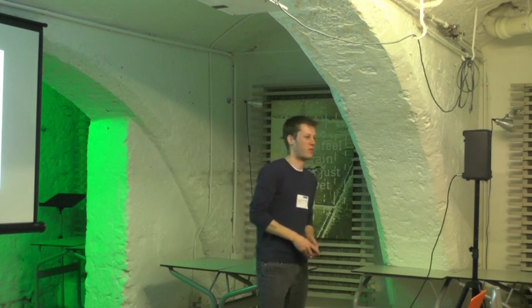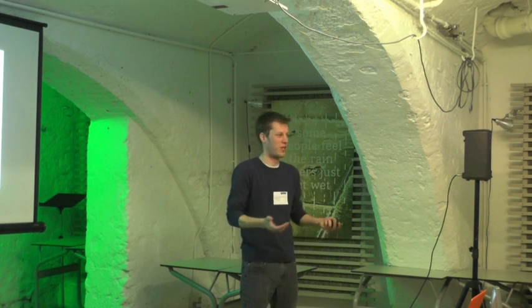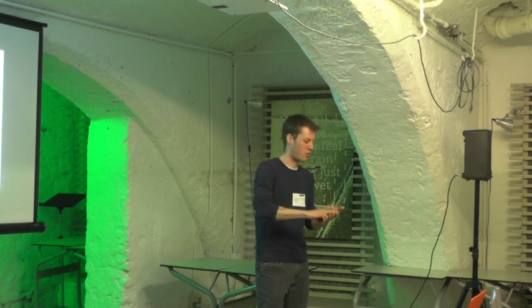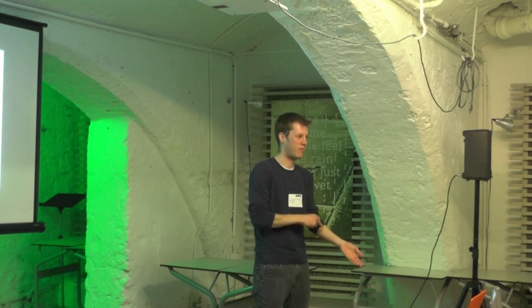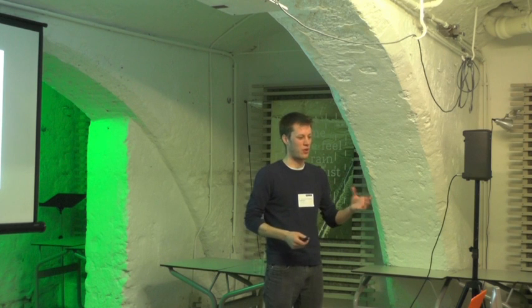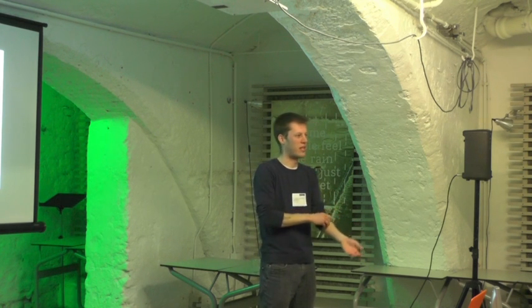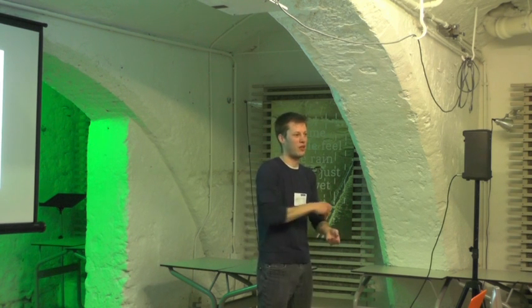That didn't work at all, because it was just confusing for him, because motors were jumping on and off, and he couldn't even get to the point of starting to learn it. So through some steps, we basically went down to having one finger directly connected to one motor on the arm, so every finger had its own dedicated motor. But that again led to a problem: if you grabbed something with five fingers, for example, and then one finger slipped off, you couldn't feel the difference because there were already four motors vibrating, and you couldn't feel the one shutting down again.